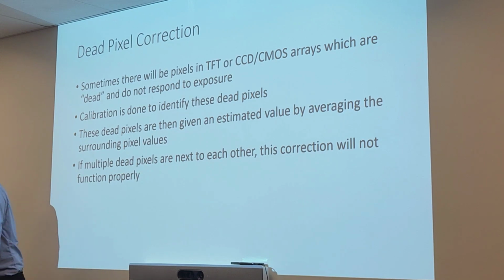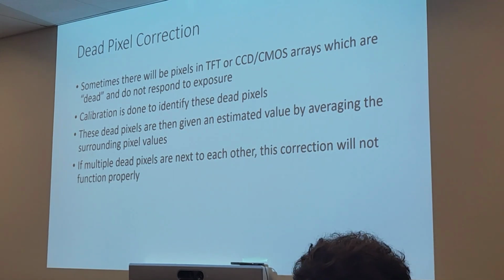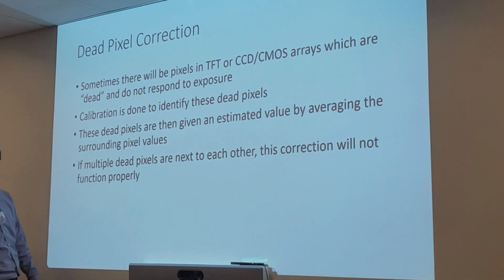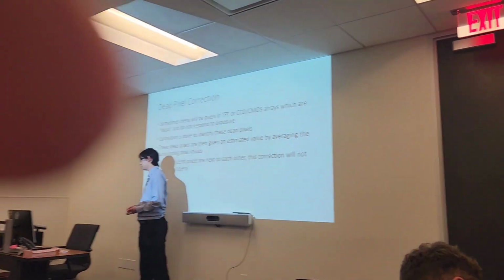All right, let's talk about our next type of pre-processing, which is dead pixel correction. Like we're feeling right now. Dead. All right, we can take a 10-minute break. But first, before we take our 10-minute break, dead pixel correction.